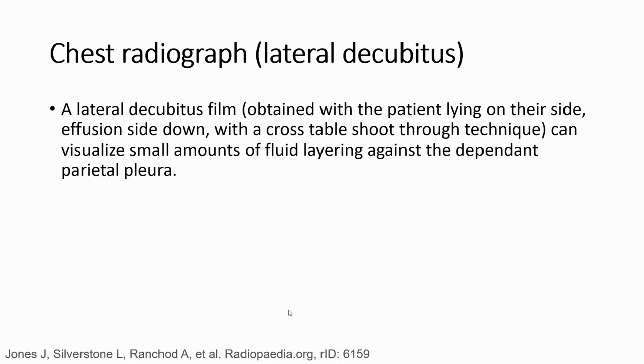Chest radiograph in lateral decubitus. A lateral decubitus film can visualize a small amount of fluid lying against the dependent parietal pleura.